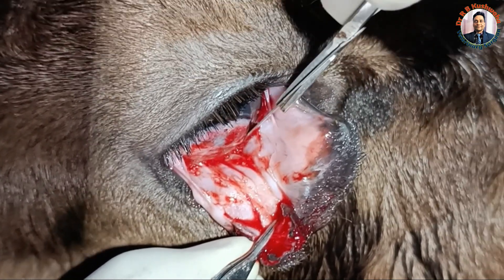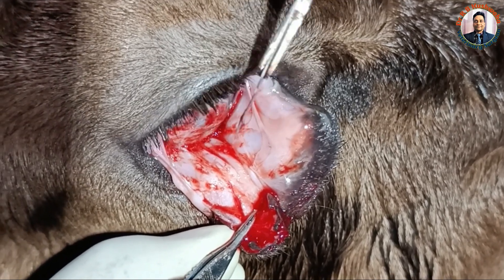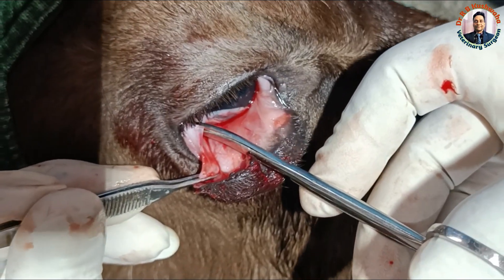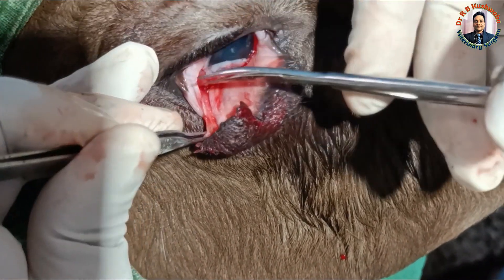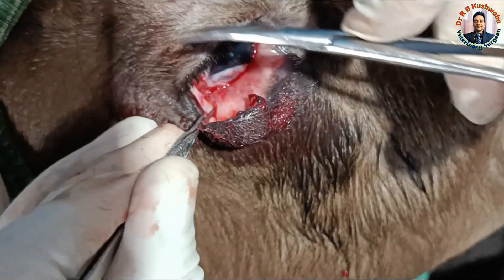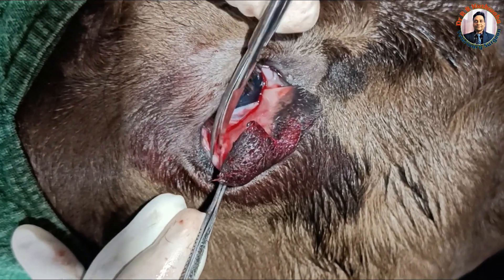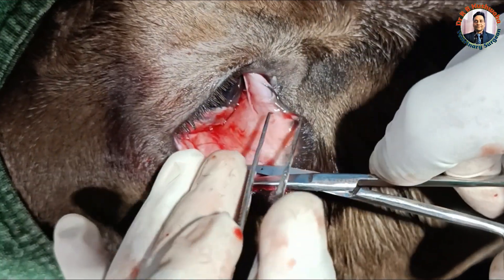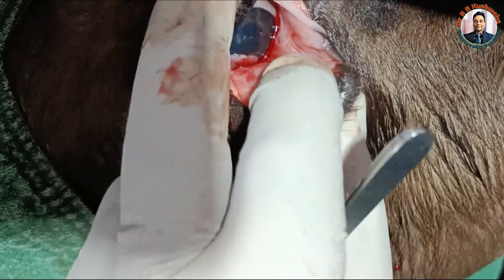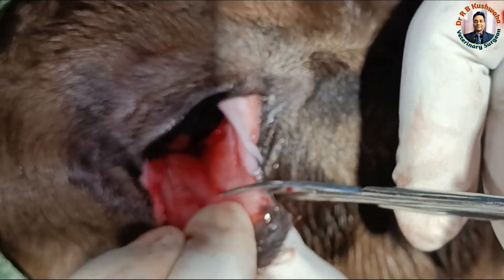Carefully dissect this one. This is attached up to here, so I will cut with this — this is the curved iris scissors. If you see this one, this is the third eyelid, so I will try to cut from here.